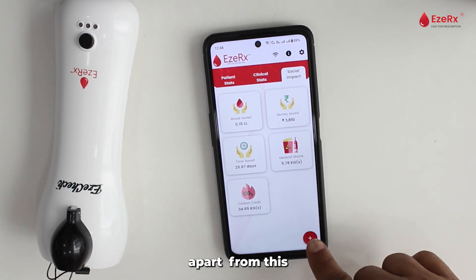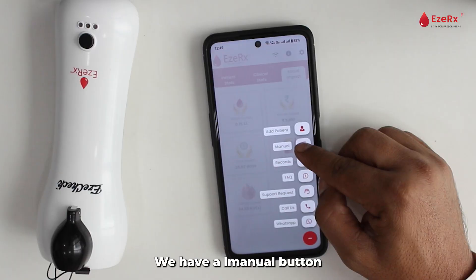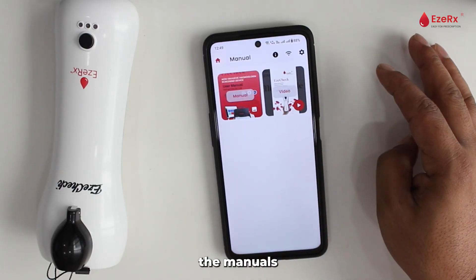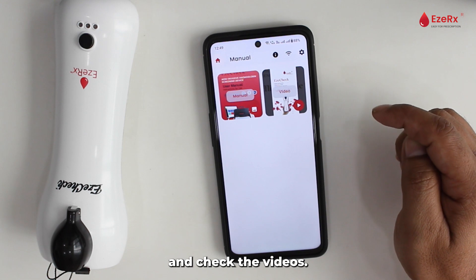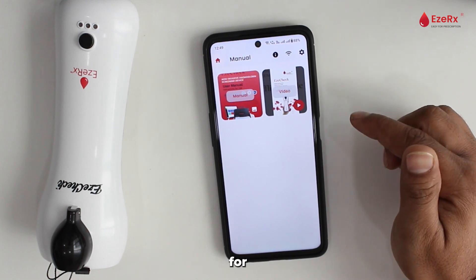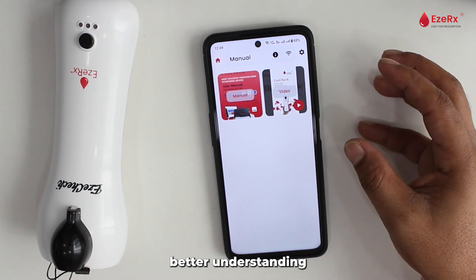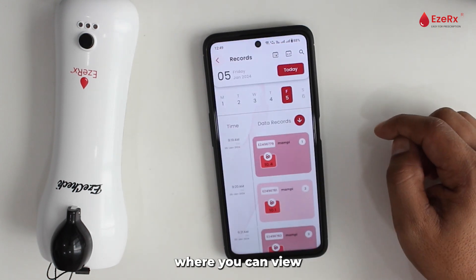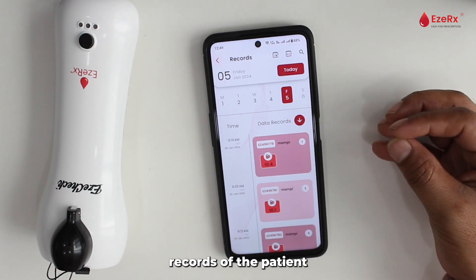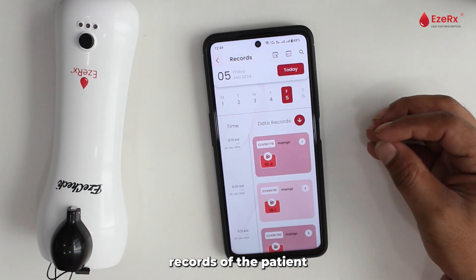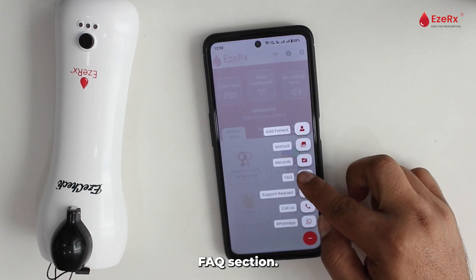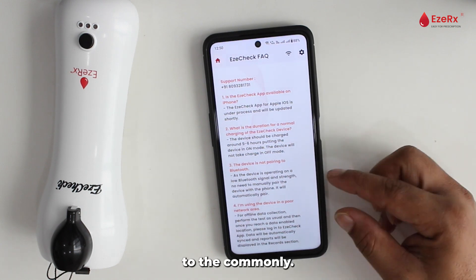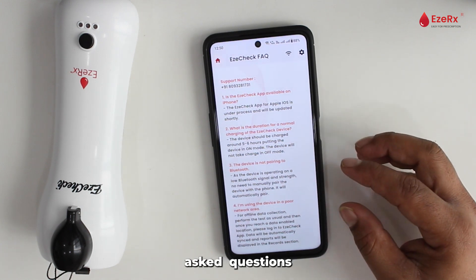Apart from this, we have a manual button where you can see the manuals and check the videos for better understanding. We have the record button where you can view previous records of the patient. We also have an FAQ section where you will get answers to commonly asked questions.